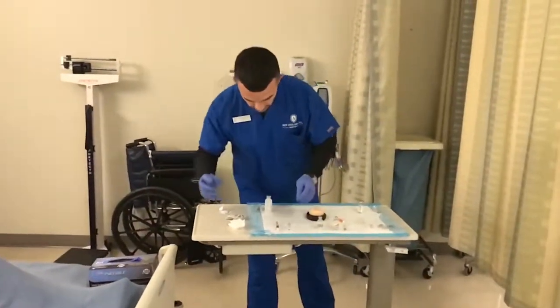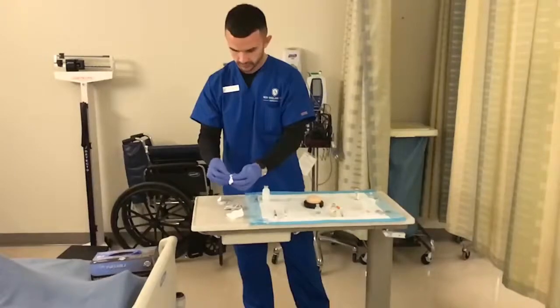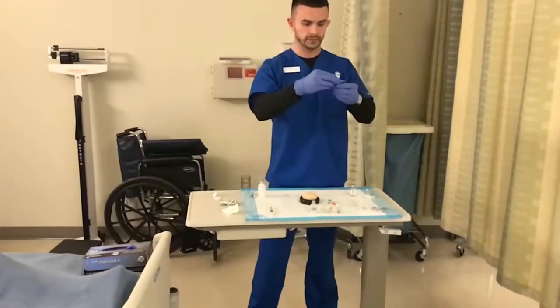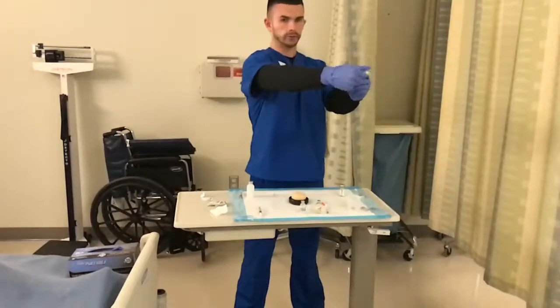So next, I'm going to be doing my vial medication. So to start with this, I'm actually going to take gauze, and I'm going to hold it away from me. And when holding it away from me, I'm going to come up and break it away.